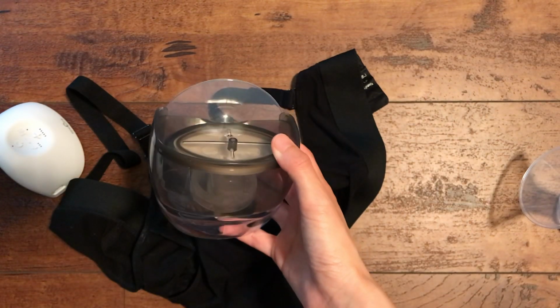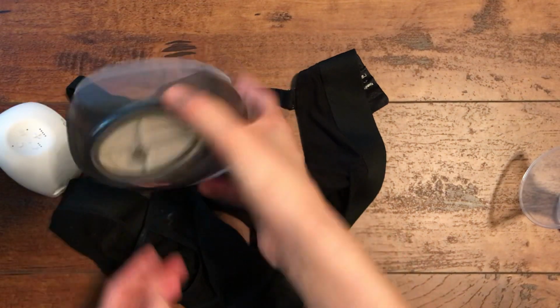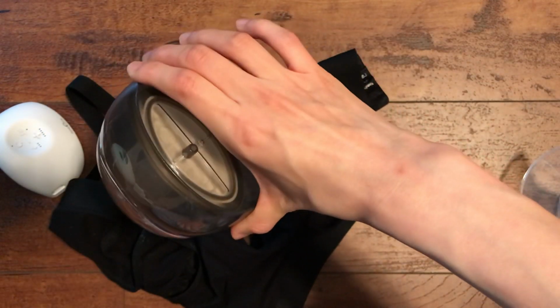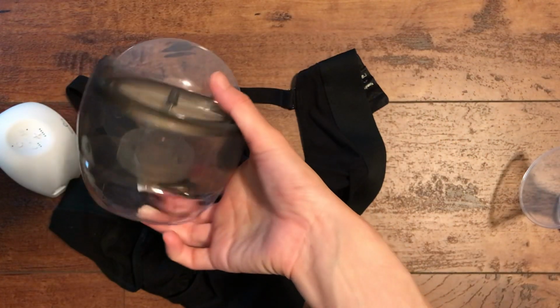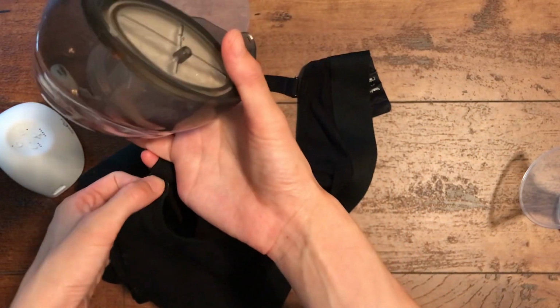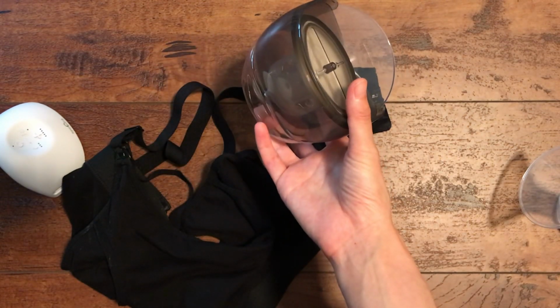And then once the pumping session is done, always grab the unit by the bottle, like how I'm doing here now. Don't just grab the unit like this, because this may fall off, and you don't want to waste all the milk that you've just produced. So make sure when you're grabbing it, grab the whole thing, and then gently take it out. And when you're taking it out, obviously you're done, so you don't care about the suction anymore. So you can just unhook it and take it out, or you can take it out from the top. So yeah, there it is.